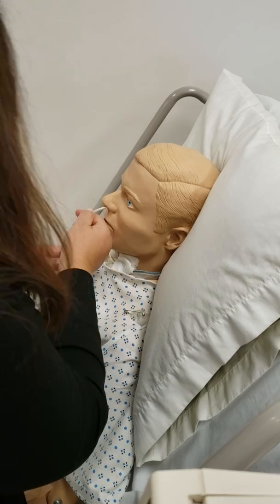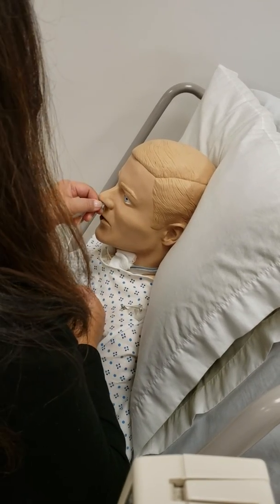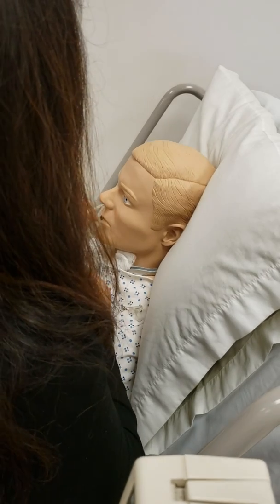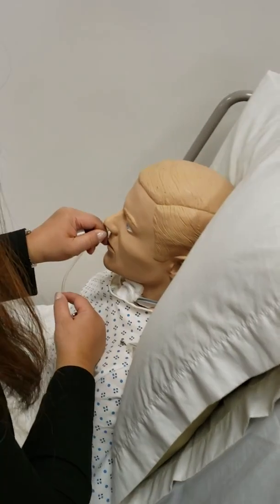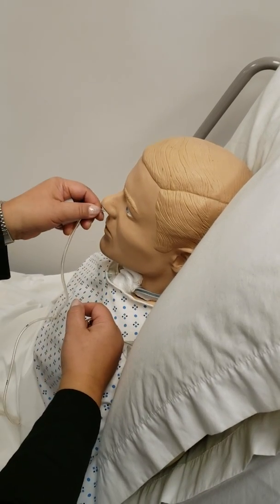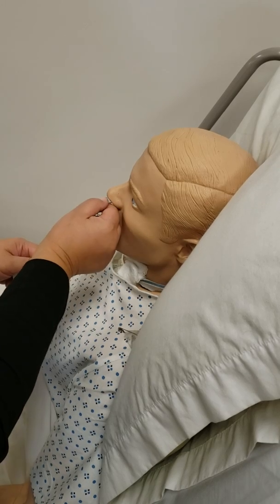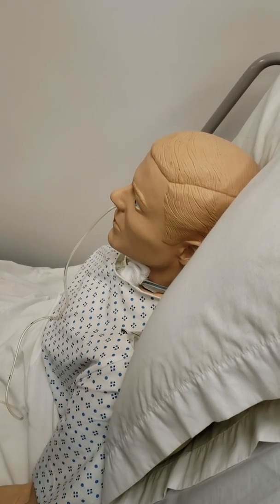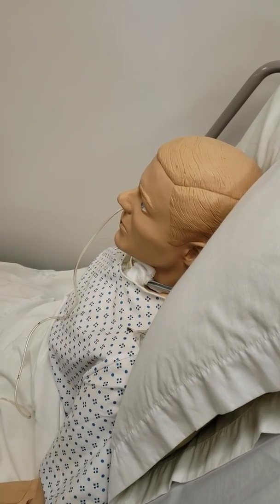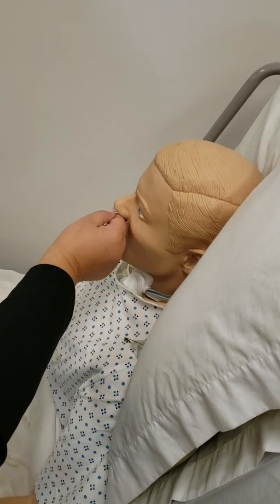So when we insert this on the patient, we ask the patient to sip some water, and you ask to swallow saliva, so that it can move. Every time they swallow, you would advance. This is a mannequin, so there's something blocking over here.